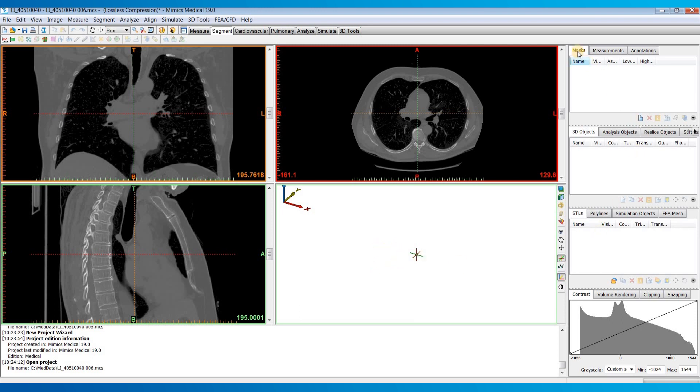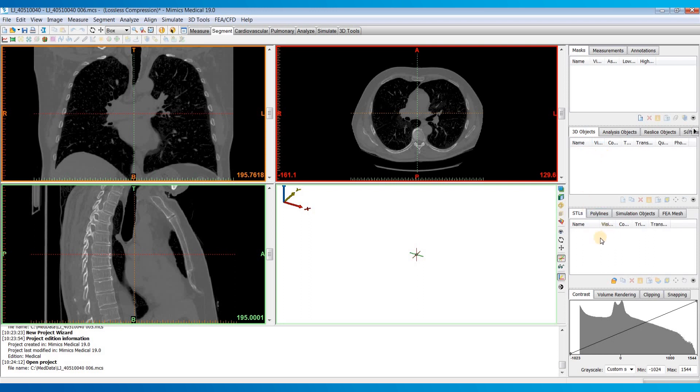On the right hand side of the software is our project manager. We have different tabs for our masks which are our segmentations. 3D objects are below that which are 3D models. Below that is the tab for any STLs that you import. And then in the bottom right is our contrast tab which we can use to adjust the windowing of our images by dragging these points around.